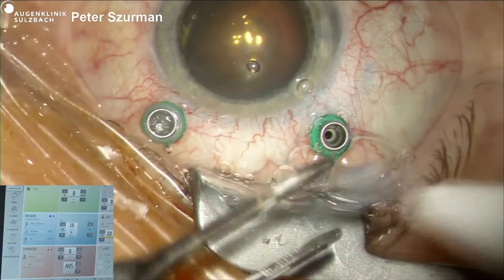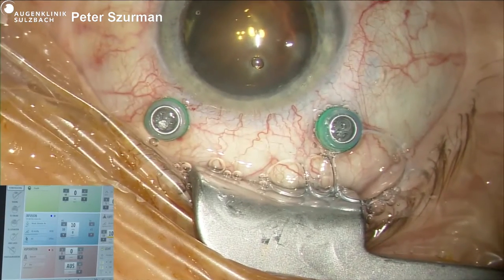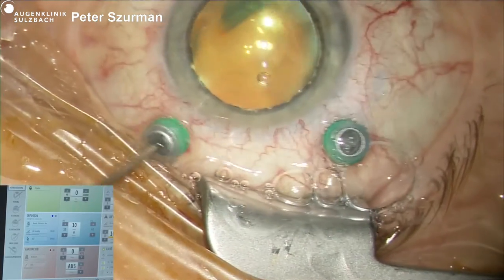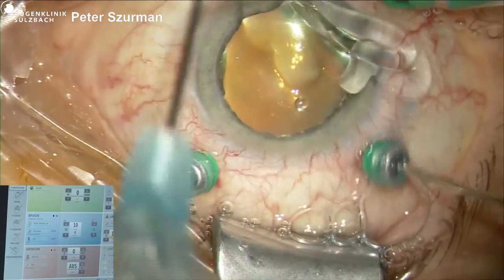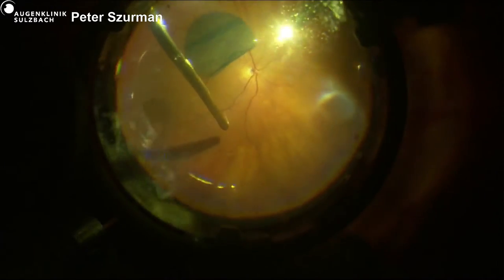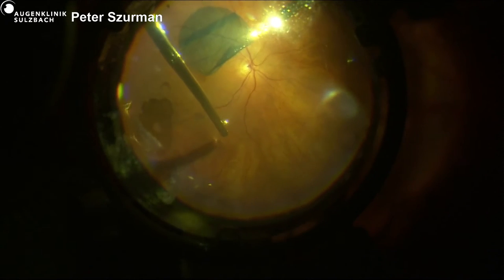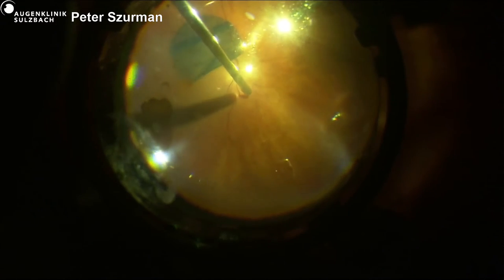The other way around. Okay, now we have a stable posterior chamber again. Vacuum cleaner. Vacuum cleaner. Okay, so under PFCL, it's a little bit easier to introduce it, but it's more difficult to expand it. So there are advantages and disadvantages. Draw up air.